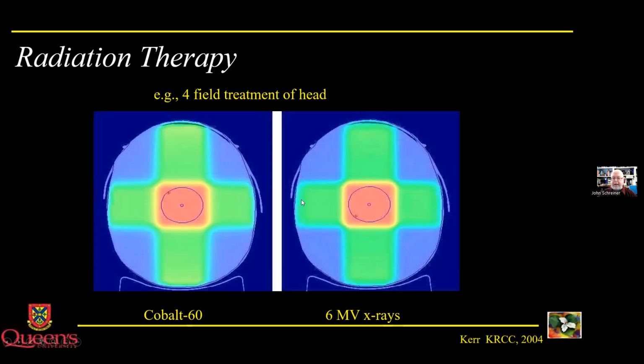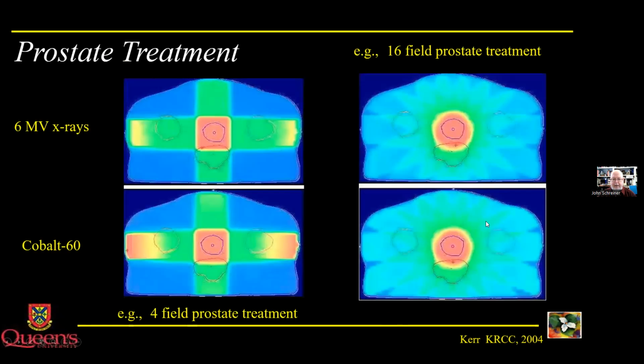And that's why these machines are made to be able to rotate around the patient, so that we can bring in the radiation from multiple directions, always aiming at the target from each of the directions and shaping the radiation beam so that it is just covering the target. And we'll look at that in a second. So this is the approach to get that dose at the target at depth.